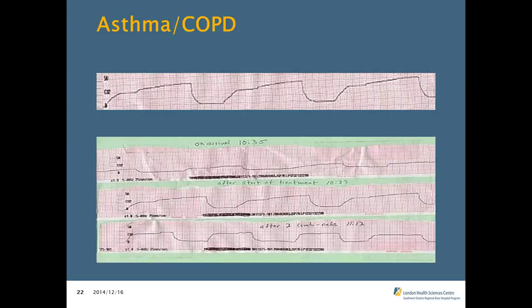So for a silent chest in someone who is in cardiac arrest, you would expect that the CO2 is going to be low because the heart's not pumping properly, not delivering that CO2 to the pulmonary system, they're not breathing, so they're not getting rid of any CO2. The cells have stopped working. They're not producing CO2. So, with that kind of silent chest, depending on what part of the arrest, if it's early on versus late, it all depends on the patient. So again, with these kind of questions, there's not one single answer.